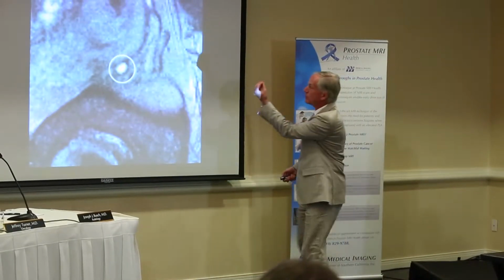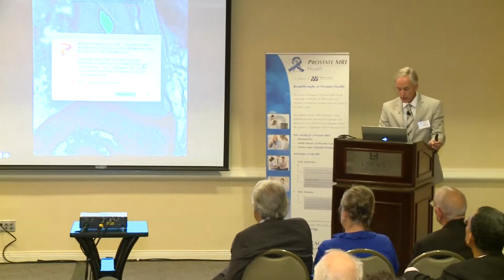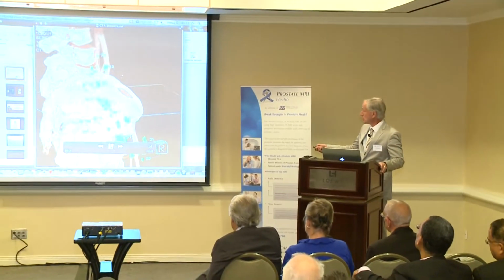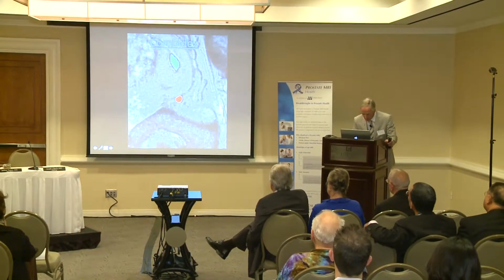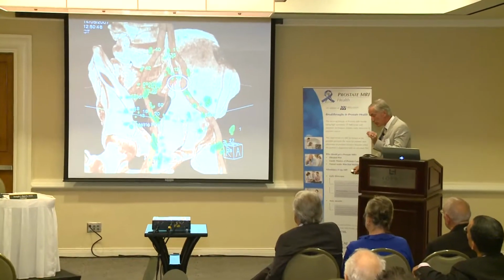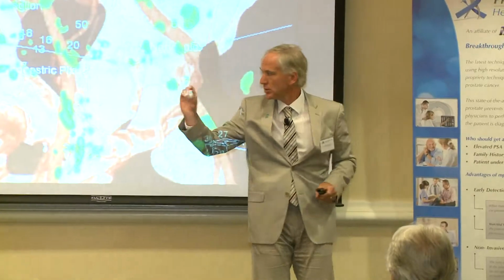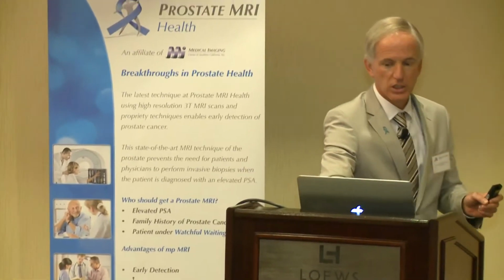Now what we can do is colorize those lymph nodes. Make them red, make them green. And now I'd like to see a movie. We can, for the radiation oncologist, plot this. CT with MR fusion. Combidex, diseased lymph nodes over there. Let's go back to the image again. You can see diseased lymph nodes, and the size of the lymph nodes in this patient was only 3 millimeters. Imagine, that's about this. And you can see them. And what you can then tell the radiation oncologist is, do selective radiation. This patient was cured. So life seemed very good.